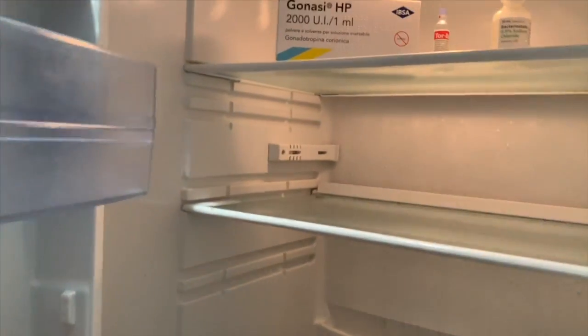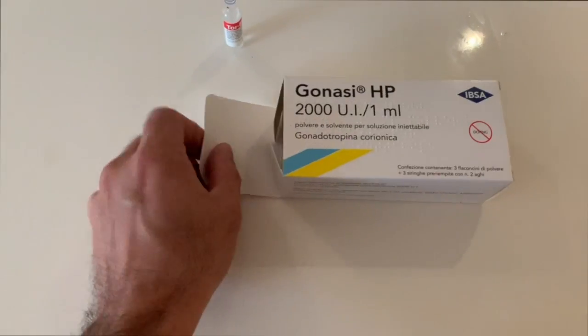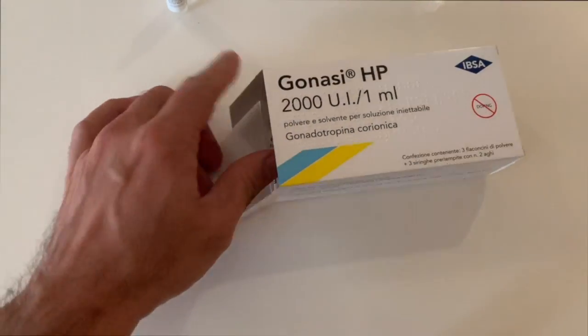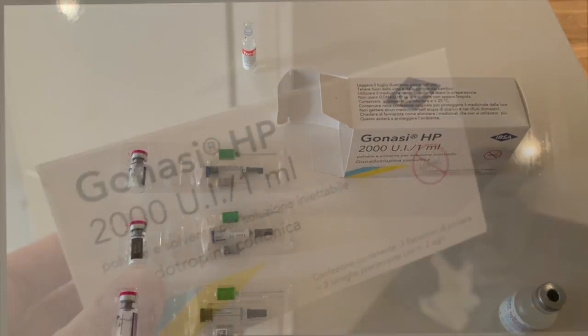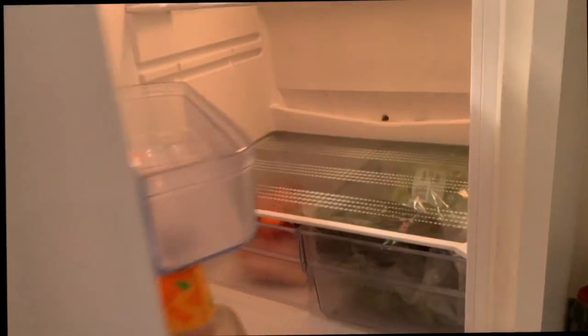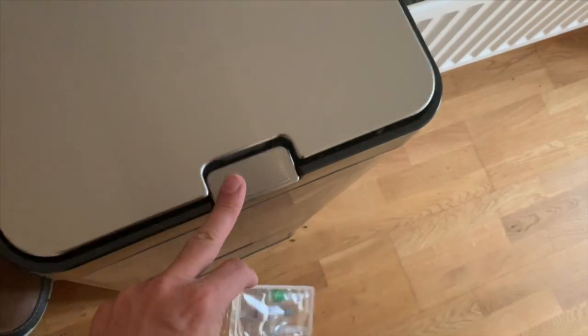Before you start reconstituting HCG, it's important to have a clean workspace. When you receive your HCG from the pharmacy, it's best to store it in the fridge. This brand of HCG is called Gonasi. Set two packages aside — these will be returned to the fridge — then discard the rest in the bin.